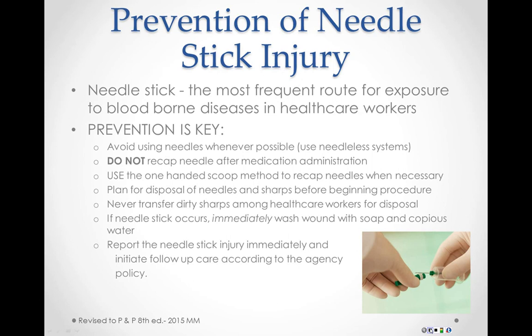Never recap a needle after medication administration. The needle is contaminated with the patient's blood and body fluids after use. Use a one-handed scoop method to recap needles when absolutely necessary. Never use two hands to recap a needle. Plan for disposal of needles before beginning of procedure by locating the sharps container in the room. Never hand contaminated needles to another healthcare worker for disposal, and likewise, never accept contaminated needles for disposal.